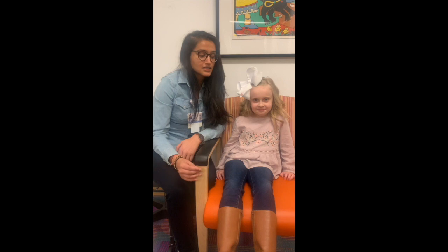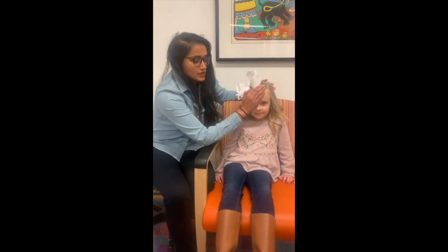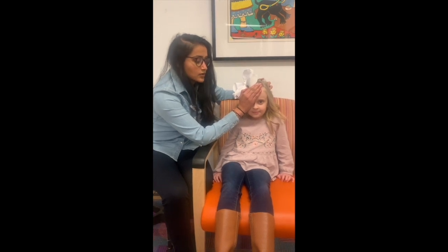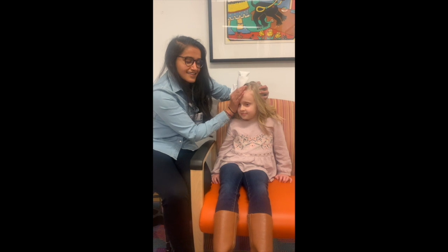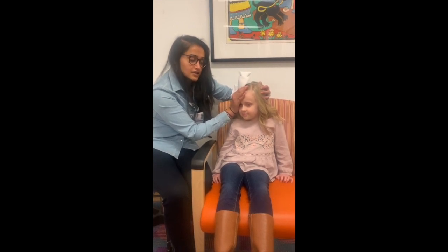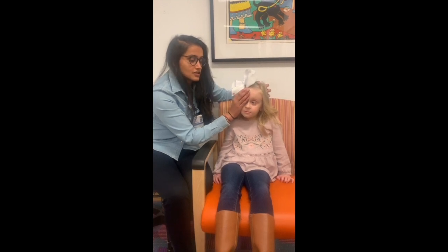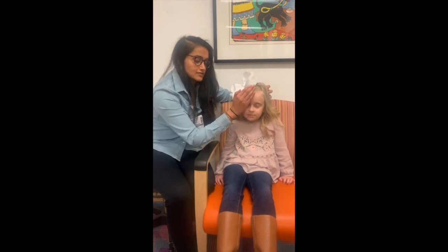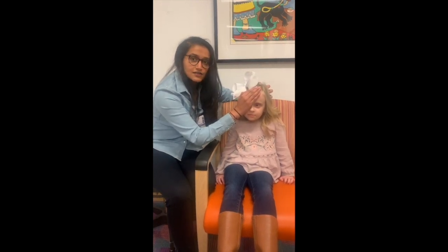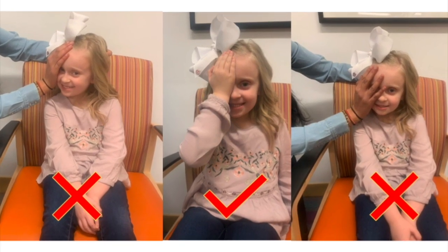When testing your child's vision at home with each eye separately, we need you to cover their eye with the palm of your hand, just like this. We don't want them to be able to peek. So if they're turning their head a little bit, they may be able to peek out with their eye, so we want to keep the head straight. We also don't want you to cover the eye with your fingers because they may be able to peek through. So again, just with the palm of your hand, covering the eye that is not being tested. If the child is old enough, they can cover their own eye.